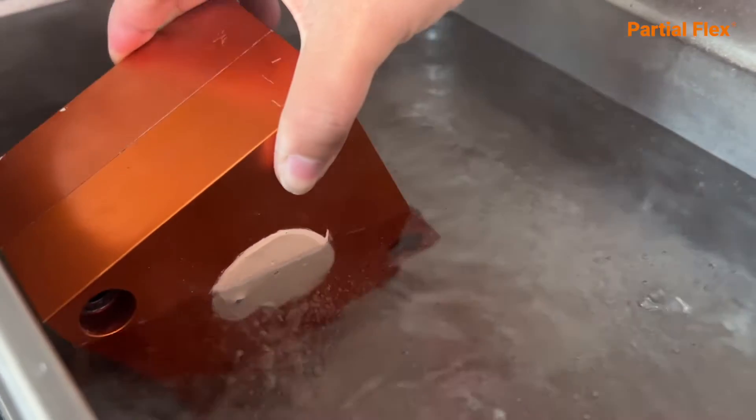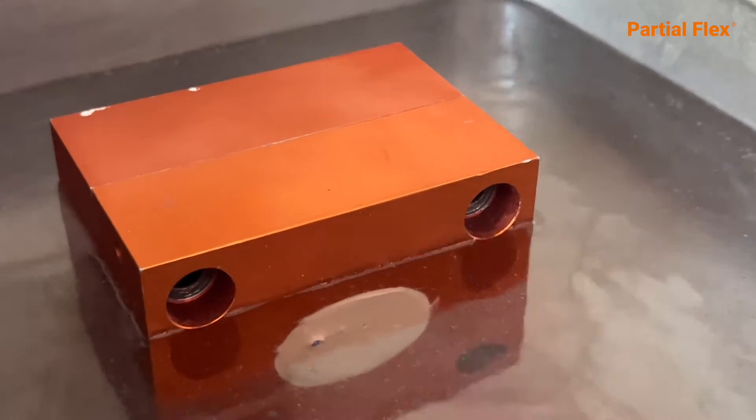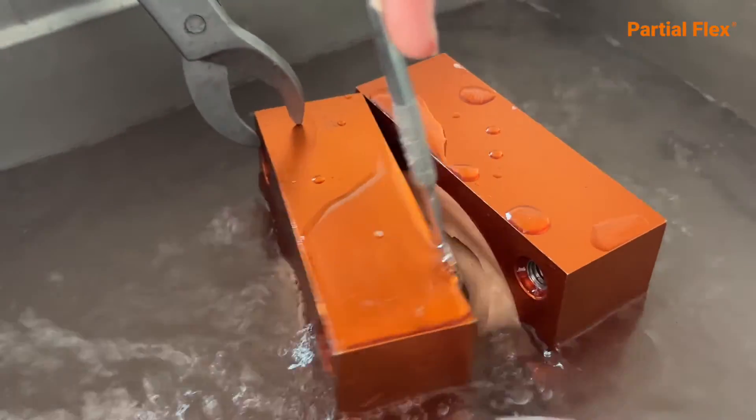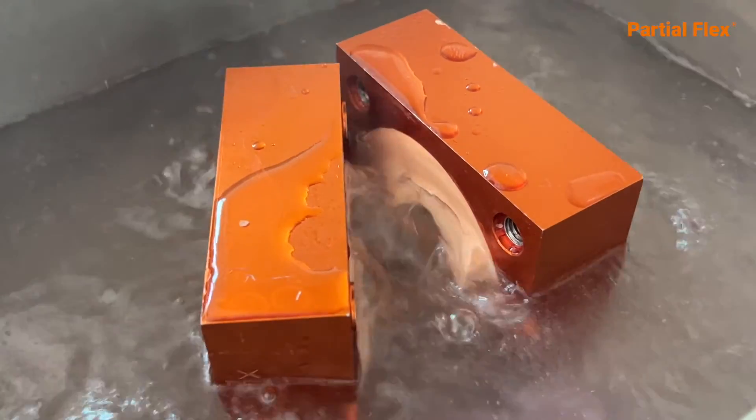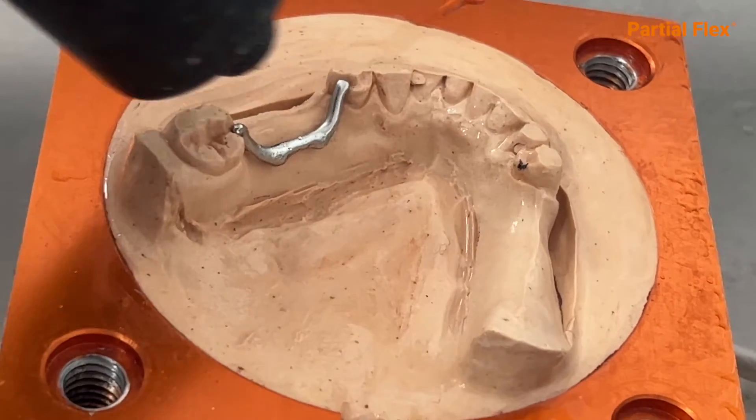Let it sit in water at 100 degrees Celsius for 15 minutes and open the flask. Remove all remaining wax with a brush or vaporizer.